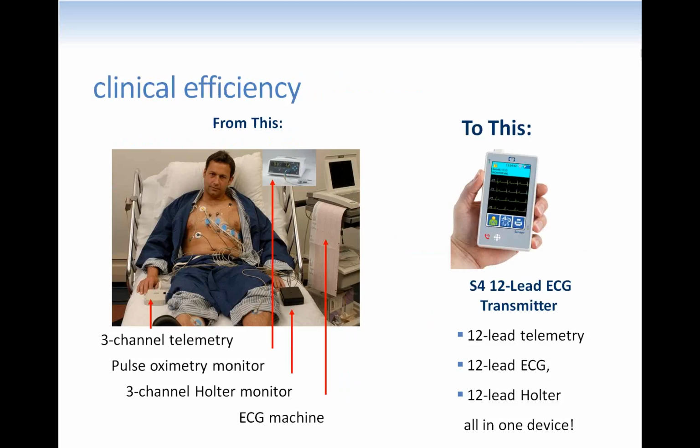Many of you have spent a lot of time and years in the clinical pharmacology unit, and so you remember the days when we connected multiple devices to subjects to get as much data as we possibly could from them. We, in the past, have used dual snap electrodes to have Holter recorders continuously recording data on a subject, while we would then also connect a patient cable from an electrocardiograph to that subject and get a 12-lead safety ECG for analysis on site as the study progressed.